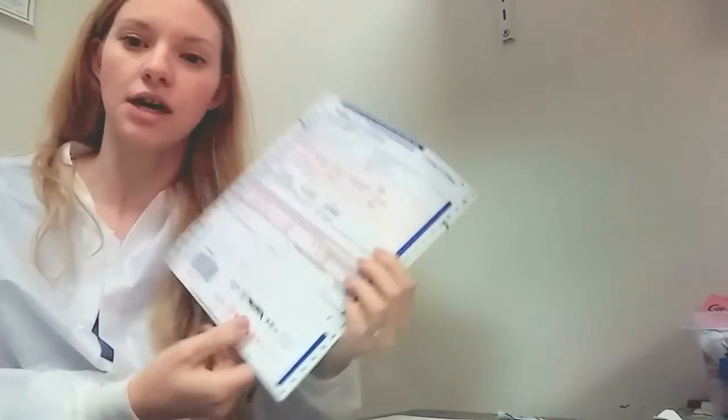So this is what one of the forms can look like. We use Medtox. I don't know if there are a lot of providers, but Medtox is a popular drug screening one. When you come in, we will fill out this information at the hospital or a lab or wherever you go to get it done. You'll have your employer name, their fax number, your name, and the reason for the test, which is pre-employment, random, reasonable suspicion, return to duty, so if you were off the job and now you're coming back on, follow-up, or post-accident.